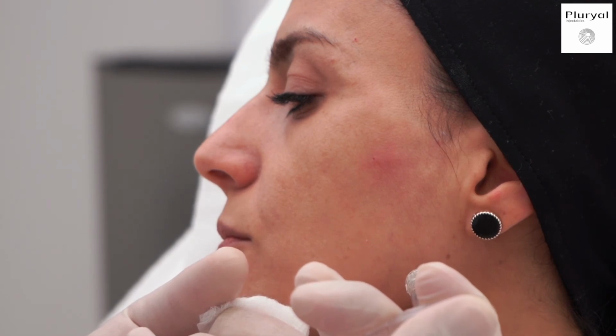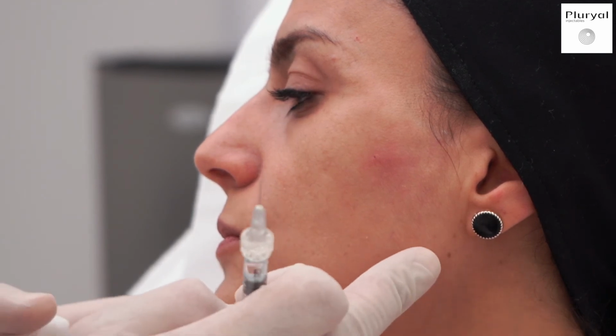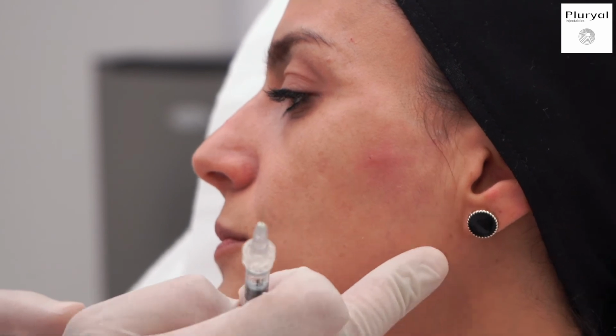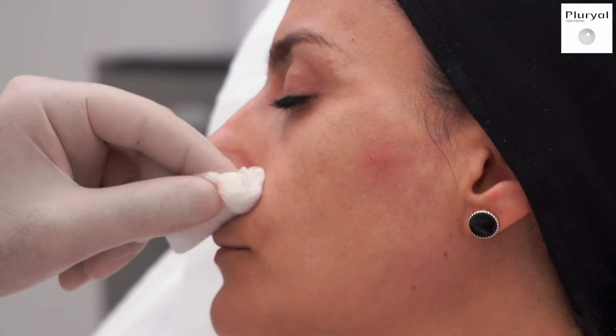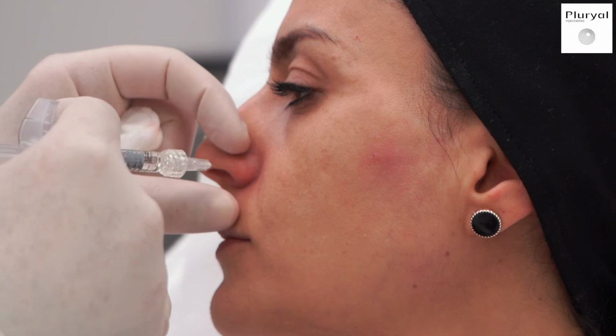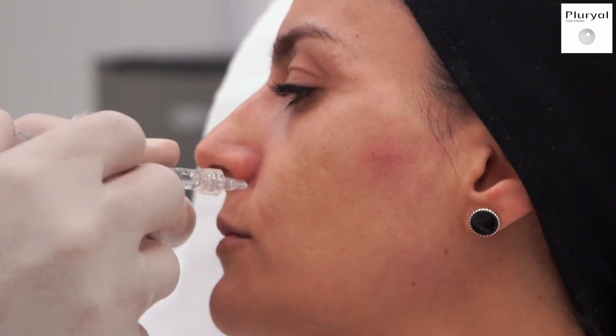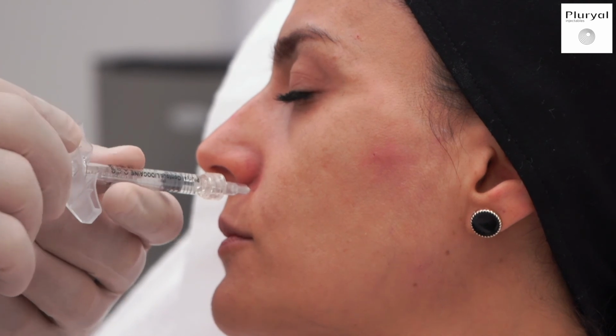This will help give a lifting effect for the lower third of the face. And I use the rest of the syringe for the base of the nasolabial fold. Always aspirate.